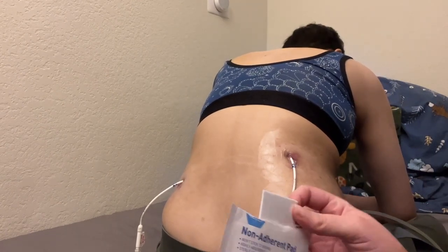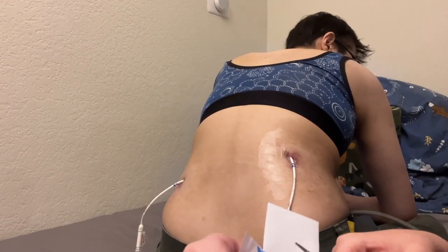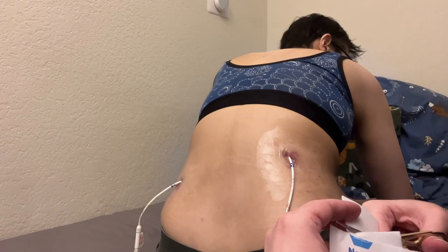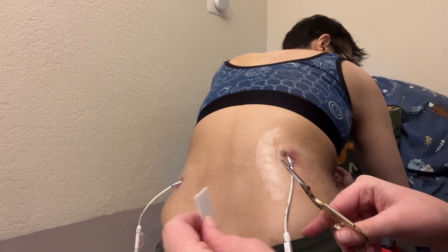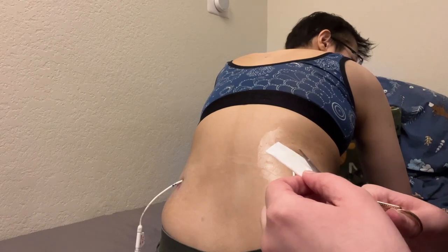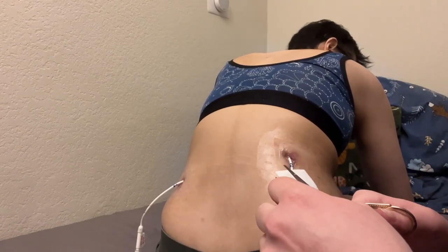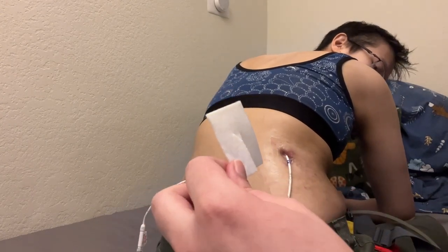When I mention non-adhesive and non-woven, those things are important because there's going to be some discharge from the stoma. That's what happens when you have holes in your body that aren't naturally there. We don't want it to get stuck to the adhesive because that'll rip and may cause bleeding and tearing. It's basically like the inside pad of a band-aid that doesn't stick to a bloody scab.